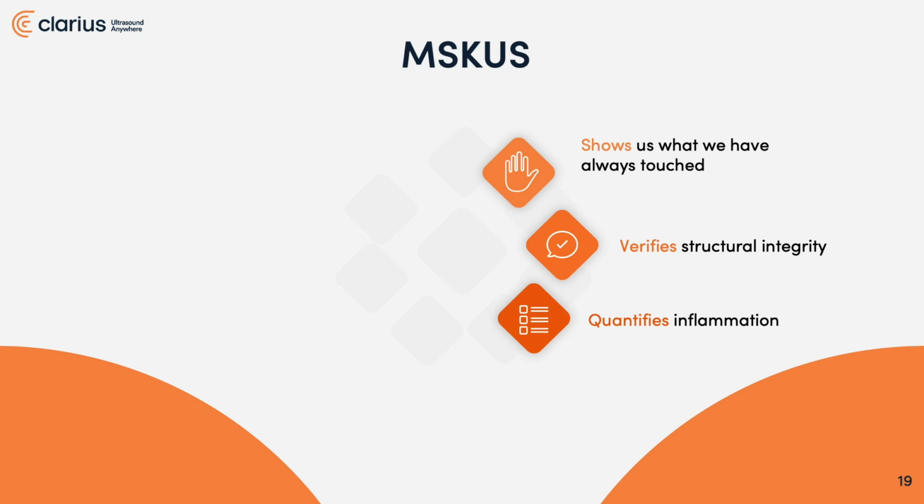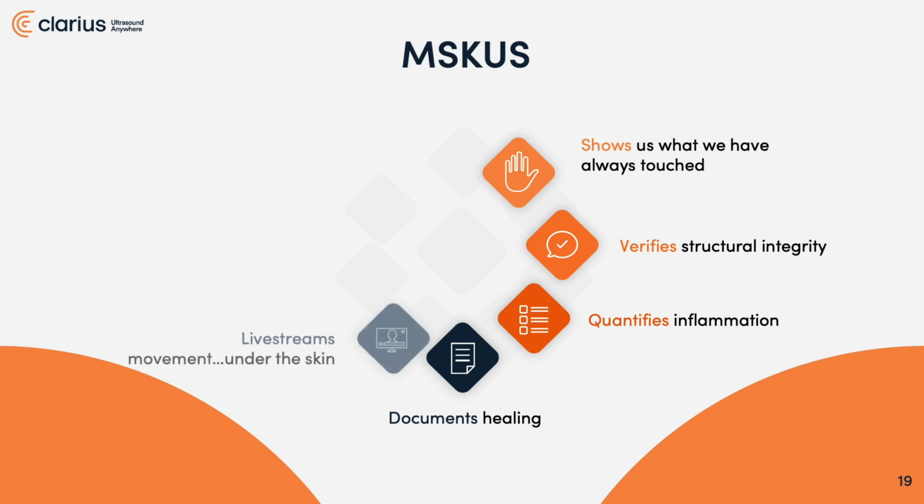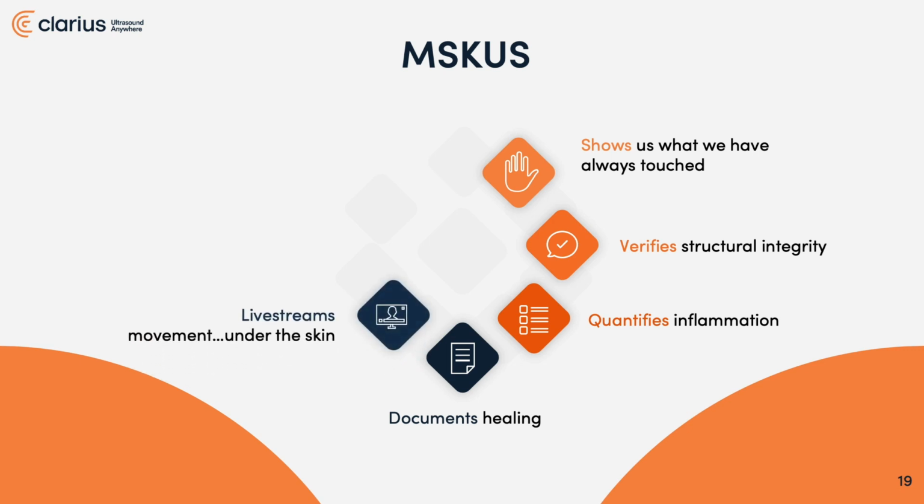That allows me to say, wow, you're quite a bit better than you were the last time we checked, but you still have a ways to go before the inflammation is completely gone. We can visually monitor inflammation changes. We can document healing as it relates to bone fracture closure. Whether a person can go back to play ahead of schedule can be determined simply based on the maturity of the callus that is filling in for a fracture. As you can clearly see, like a glass-bottom boat, you can watch whatever is happening under that probe.